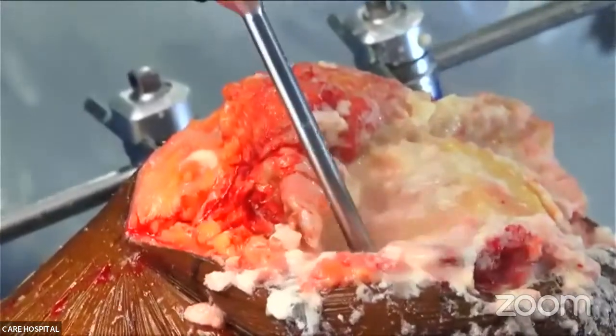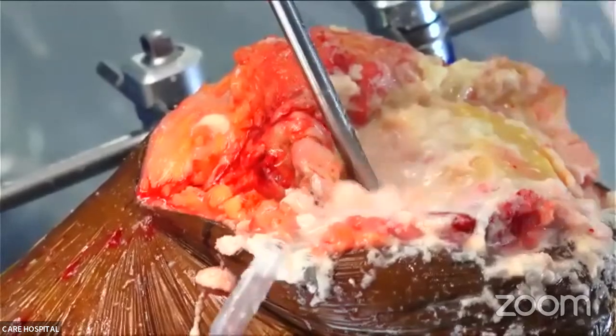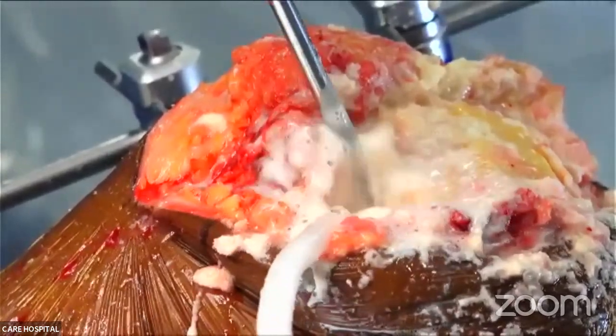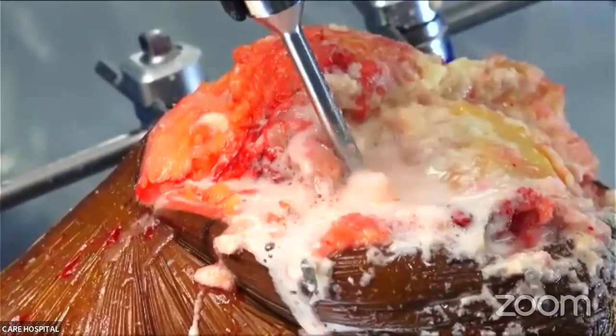No, the medullary canal need not be opened. Yeah, the medullary canal need not be opened in navigation also.